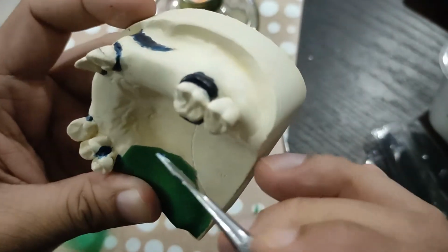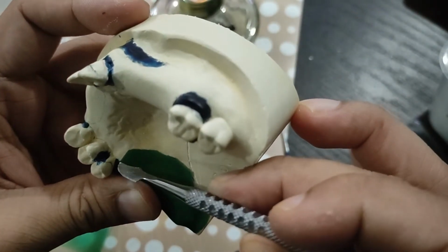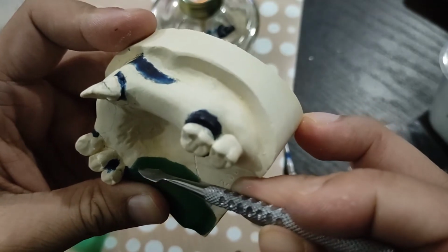So I don't think it's visible now, but I can see it through the wax where I placed the borders. So I just have to follow that.